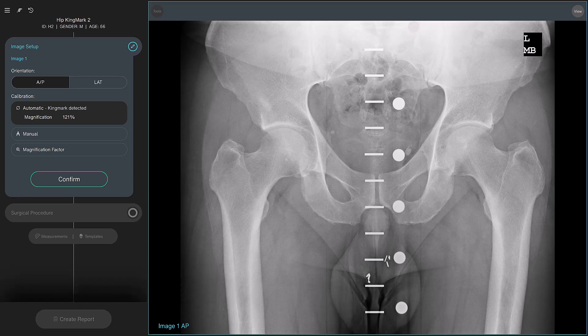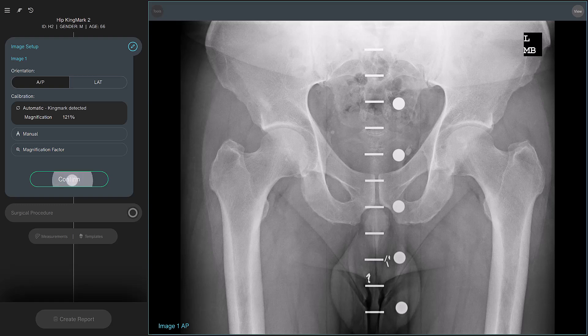TraumaCAD NEO has automatically detected that this is an anterior-posterior image and not a lateral one, and has detected the existence of a Kingmark calibration marker. So at this point, you can simply confirm that these parameters are correct.